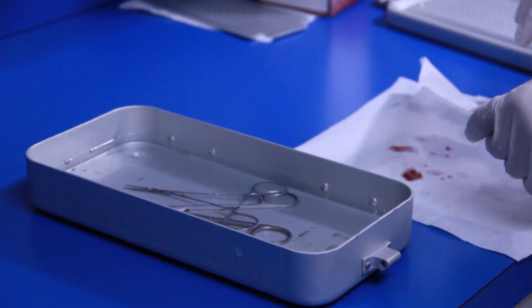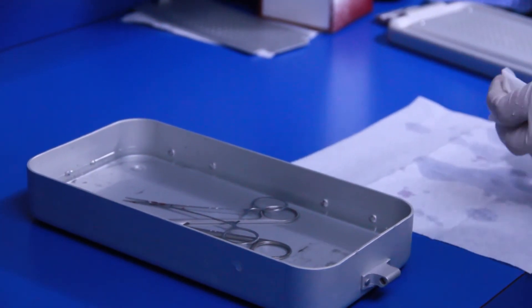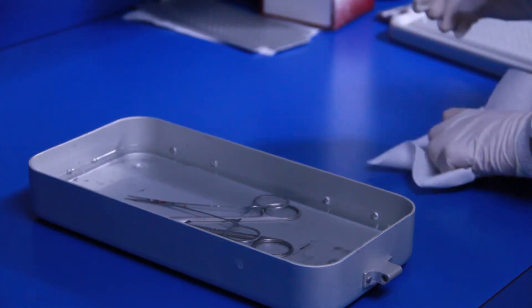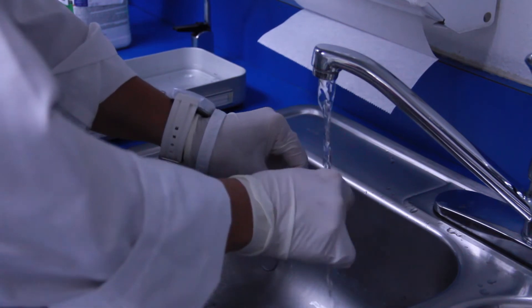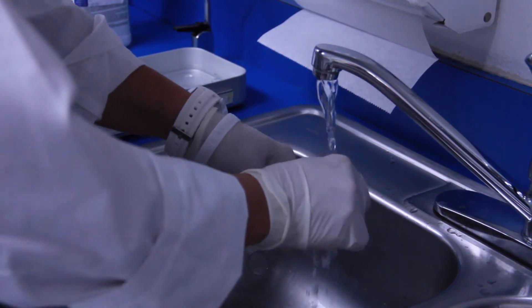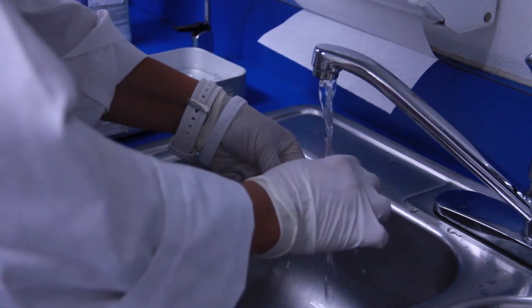To maximize the usable life of your instruments, never allow blood to dry on surgical instruments. Within 10 to 20 minutes after a procedure, open all the instruments and begin a decontamination process.